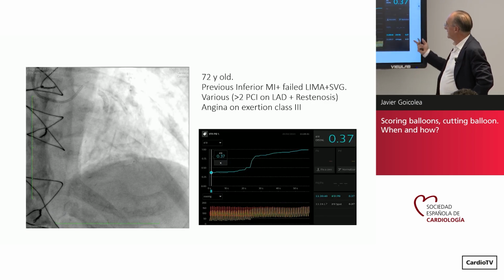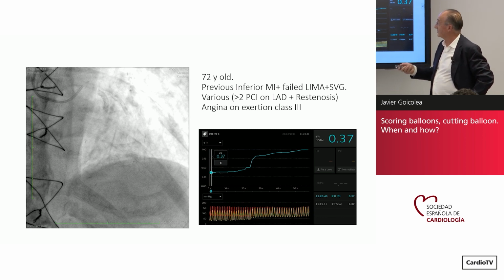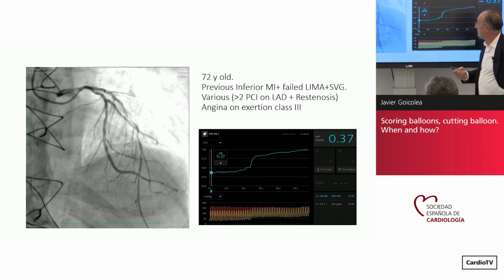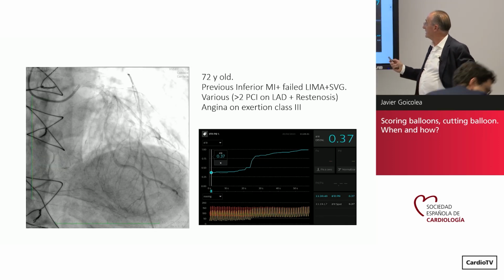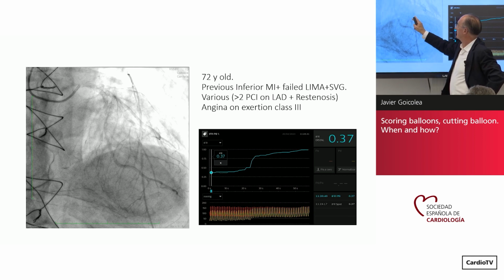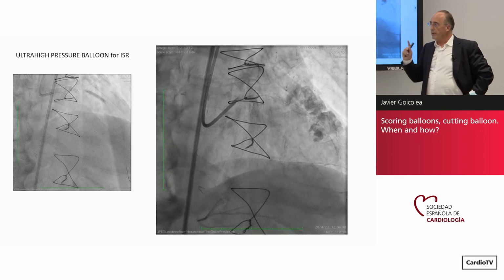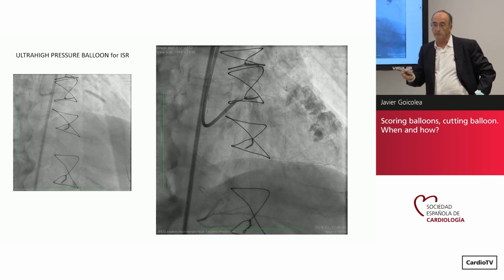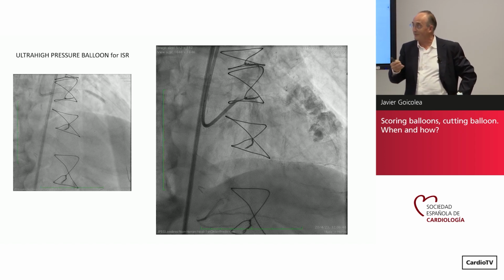When you present cases, there is a danger. I don't know why this will not go. So it's not unreasonable to do IFR with this lesion. So we went for it. There are several stents in the LAD, 2 overlapping over there and 1 there. We did an OPN balloon with intravascular imaging, and I finished with a Papyrus stent. The patient is okay because I received a message the other day, so I suppose he's okay. I tried to call him, but he wasn't there.